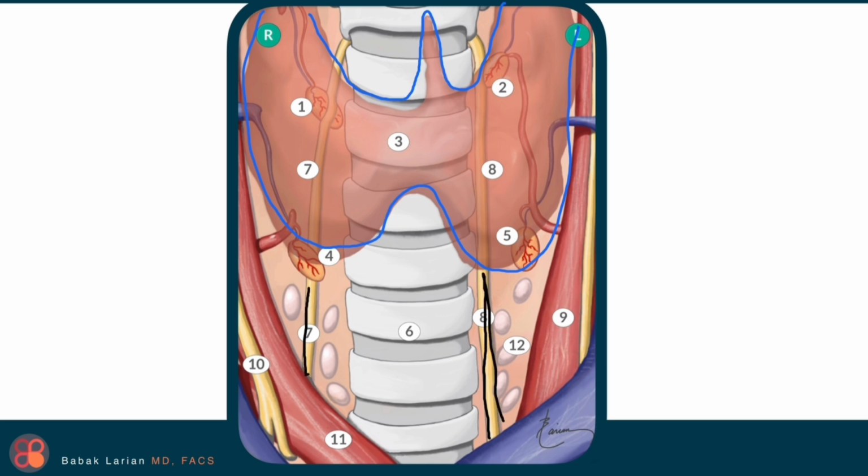Now, the lower parathyroid or the inferior parathyroid is usually superficial to the nerve. So you can see it. Superficial to that nerve. While the upper parathyroid is deep to that nerve. Same thing holds up here. This side partially deep, and although away from the nerve, it is in a layer that's superficial to that nerve. So you may be just right over the nerve itself, or maybe to the side, but somewhat more superficial.